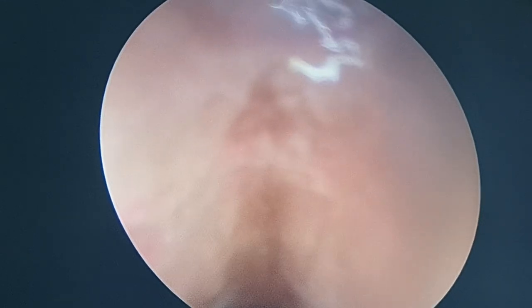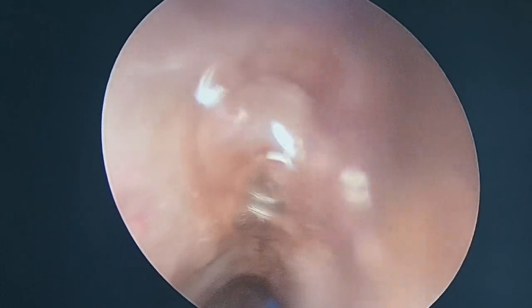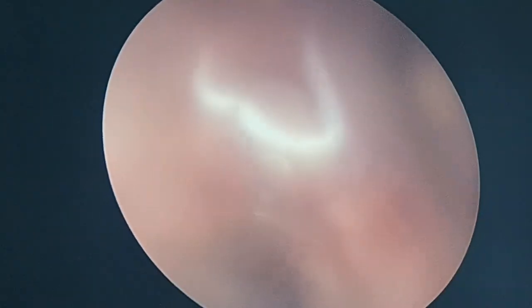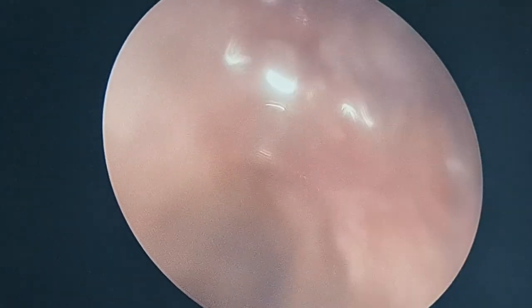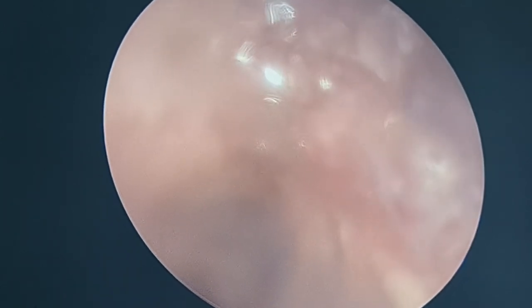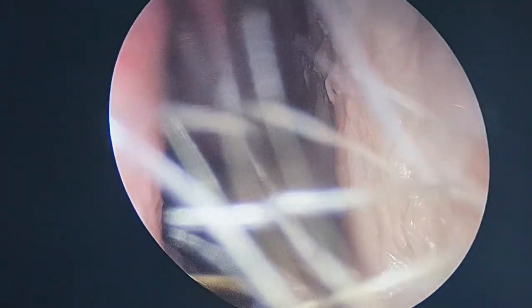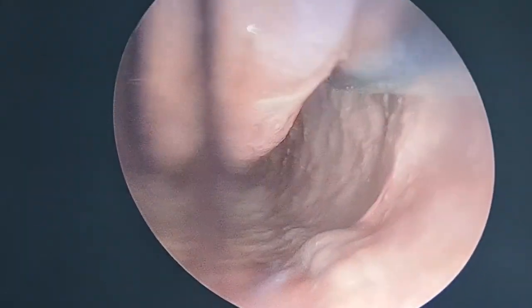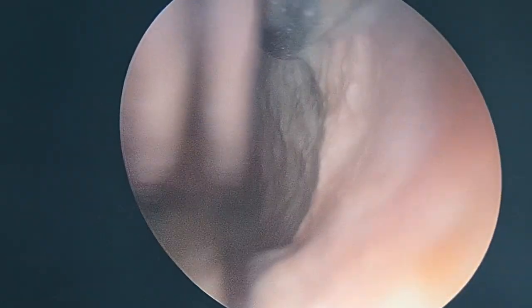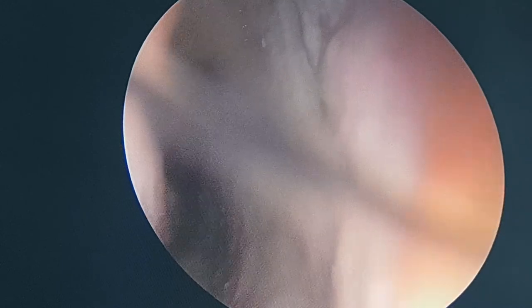That is the nasolacrimal duct. See this? This fluid is coming out as I am pressing on the medial orbital area, pressing on the nasolacrimal duct. This is the fluid coming out through the wall into the nasolacrimal duct and into the inferior meatus. The nasolacrimal duct opening is the only important anatomy you will find in the inferior meatus. See, that is the opening of the nasolacrimal duct, above.